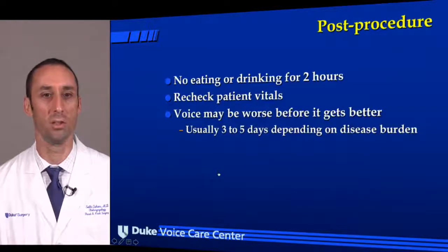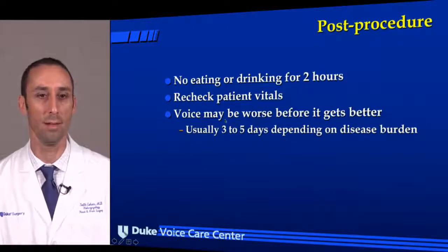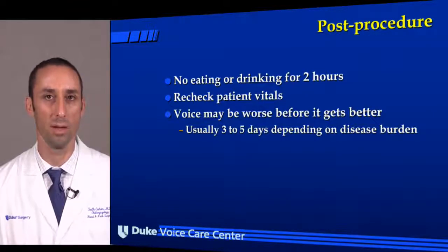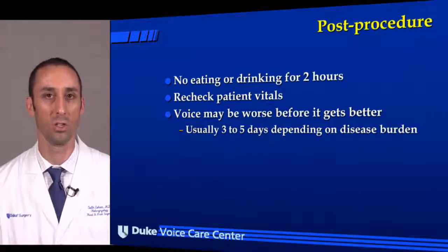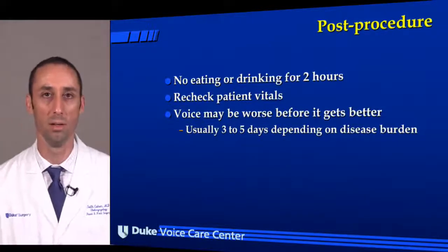So what do we do after a procedure? Again, no eating or drinking for 2 hours. You can recheck the patient's vital signs, make sure that everything's okay. And it's important to counsel patients that the voice might be worse before it gets better. You have caused inflammation to the vocal folds, you've transferred heat, you're trying to do that in a way that is as atraumatic as possible and spare the overlying epithelium, in the case of a disease such as a vocal fold polyp. Obviously with vocal fold leukoplakia or papilloma, the disease is the epithelium itself, so you have to treat that.